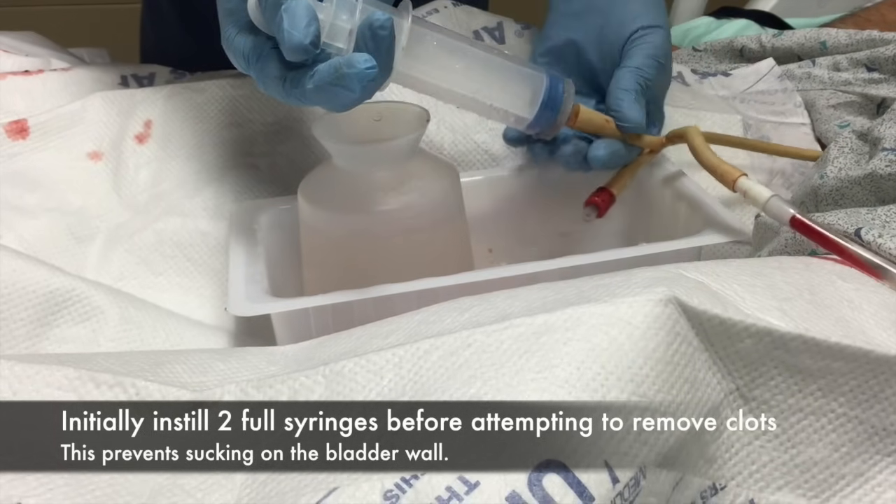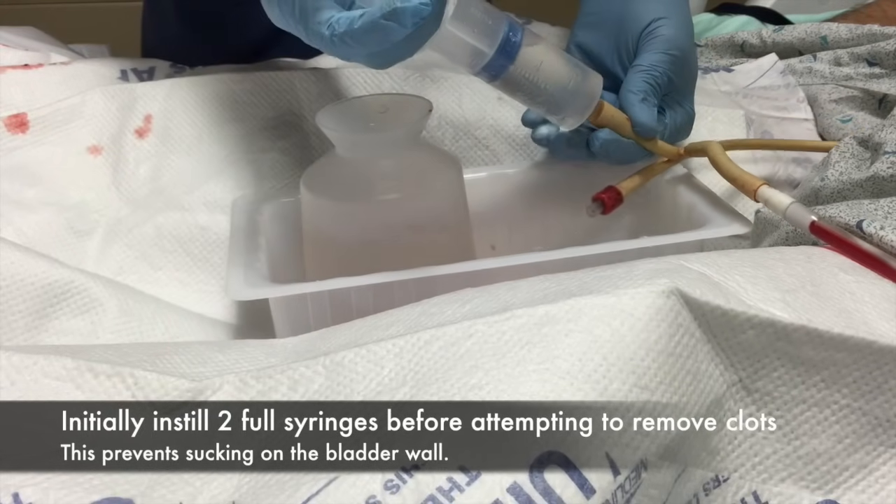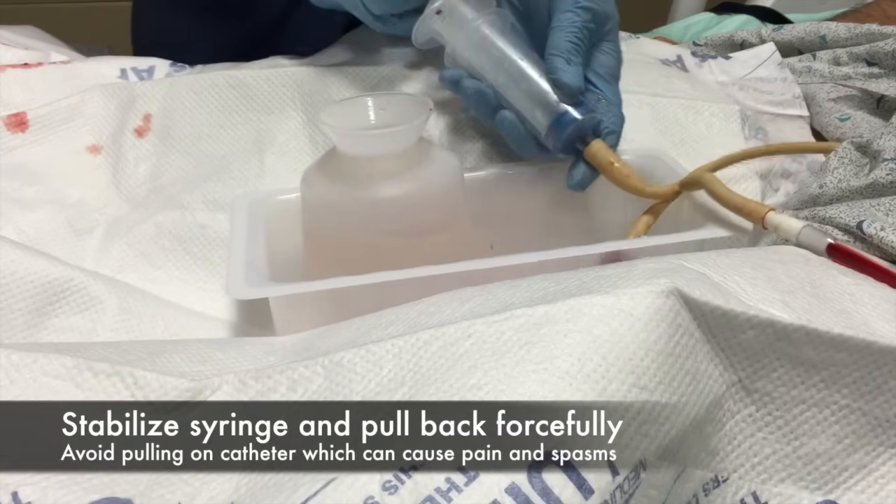The other part of the three-way is the continuous irrigation, which you see hooked up on the right. It has some blood in it, which is not unusual when the irrigation is not running, as it is in this patient.